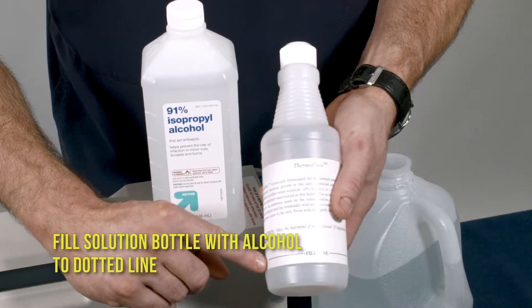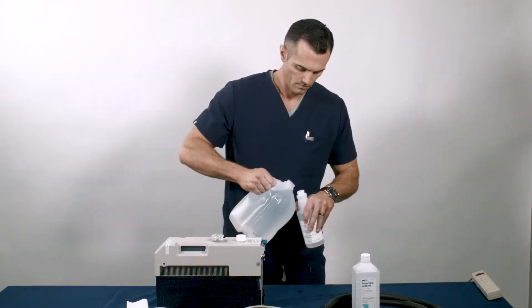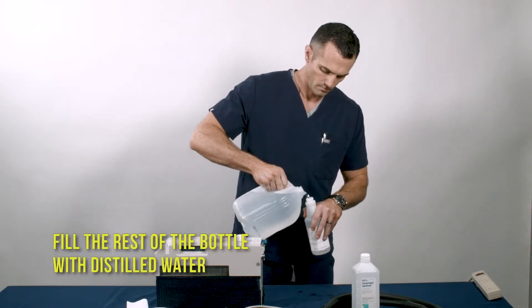Fill the solution bottle with alcohol to the dotted line. Fill the rest of the bottle with distilled water.